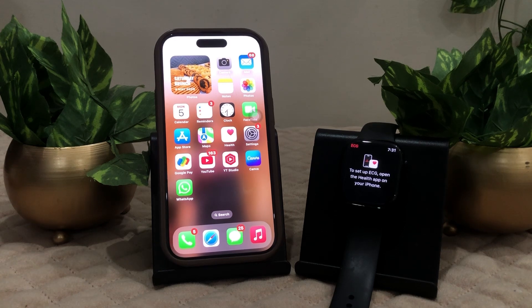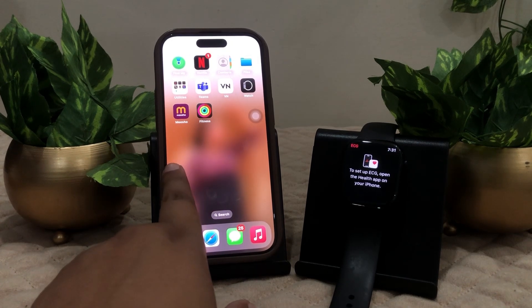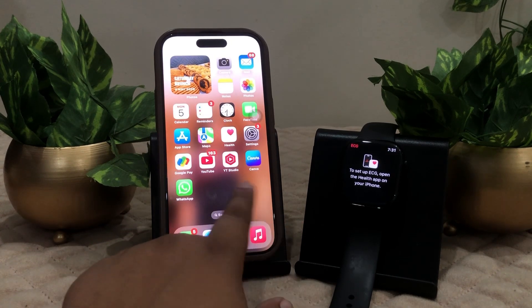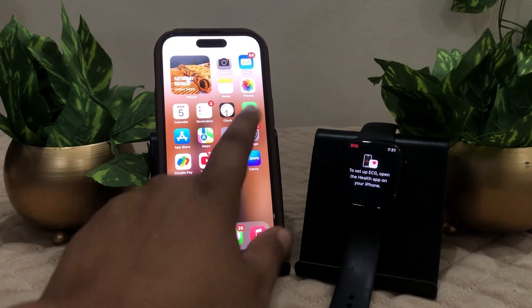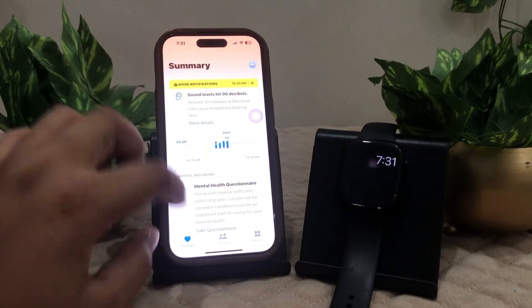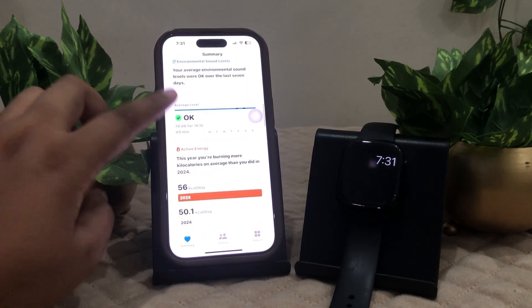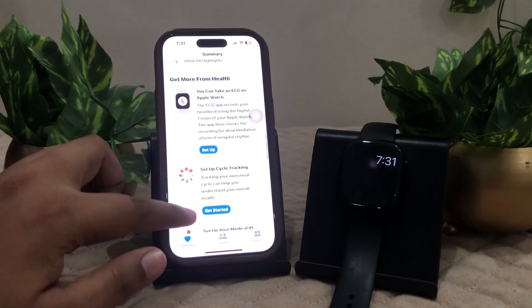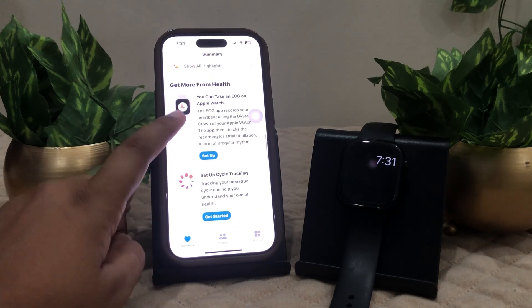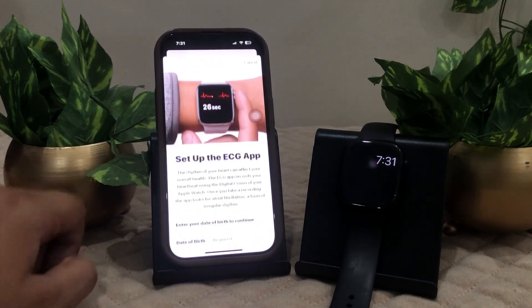After that, it says to set up ECG, open the Health app on your iPhone. On your iPhone, click on the Health app. Go to the ECG section — here it is. You can take an ECG on your Apple Watch. Click on Setup.